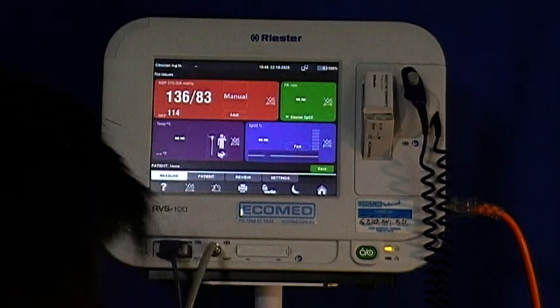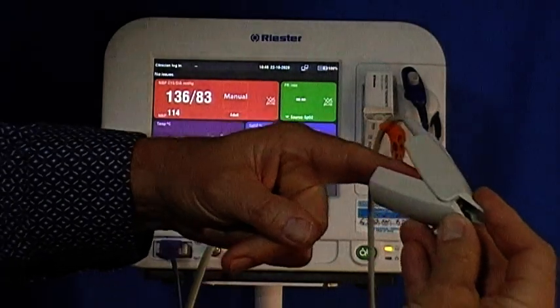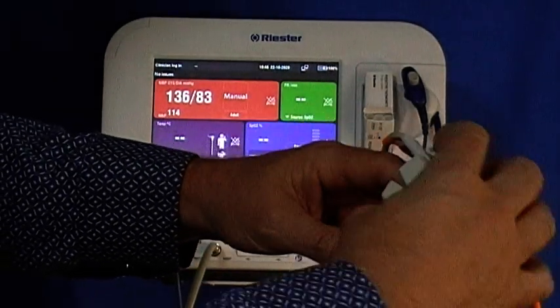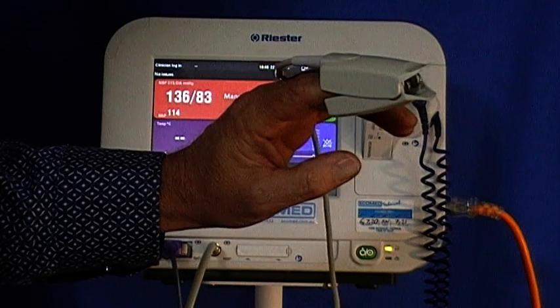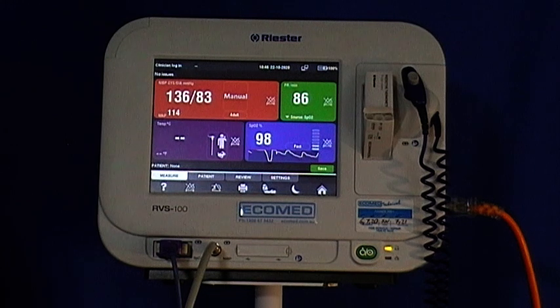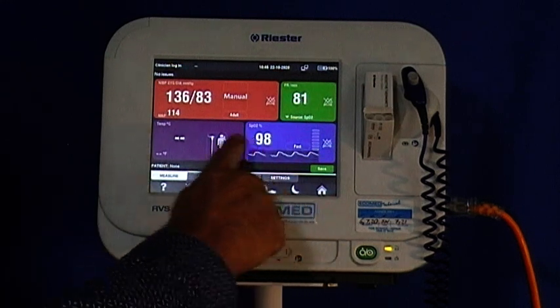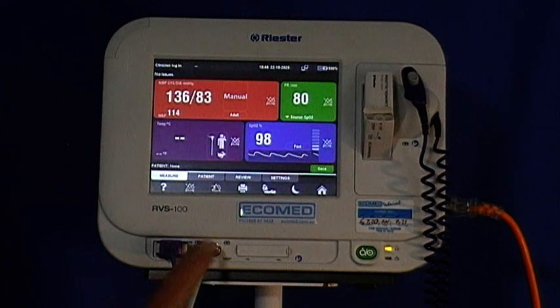The next is the pulse oximetry reading. Simply place the patient's finger inside the finger clip and ensure again that everything is connected. You'll get the plethysmograph on the bottom of the screen and you'll see there is a pulse rate per minute in the green and the SpO2 percentage, which is your oxygen percentage in the blood, shown in the blue.